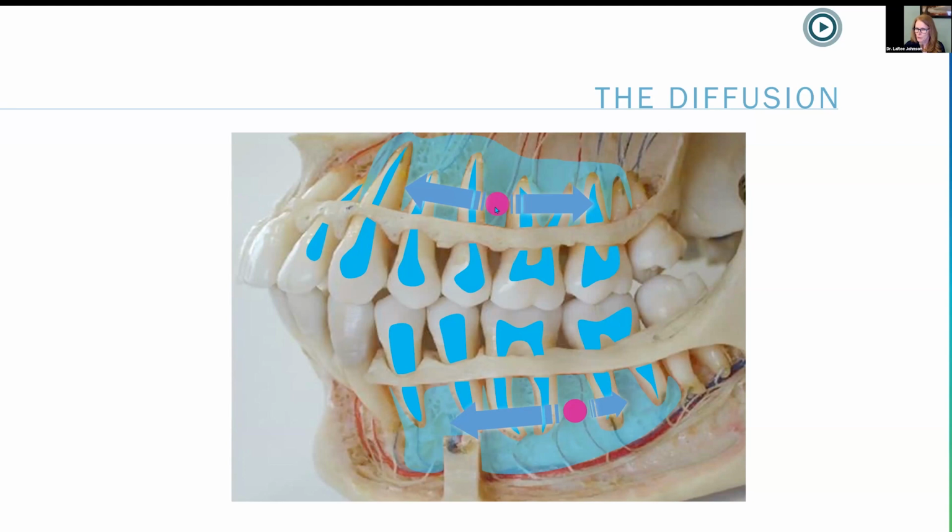What we would expect to see with an intraseptal injection is just one tooth in front and one tooth behind, because we are not getting into that osteocentral area where the diffusion can get as far as what you're seeing on these diagrams. If this were the primary dentition, yes, I would expect 2 teeth forward in the maxilla, 2 teeth distal. So 2 mesial, 2 distal in the maxilla. I would expect 2 to 3-ish on the maxilla. I would say 2 is more safe, and on the mandible, 2 mesial and 1 distal.